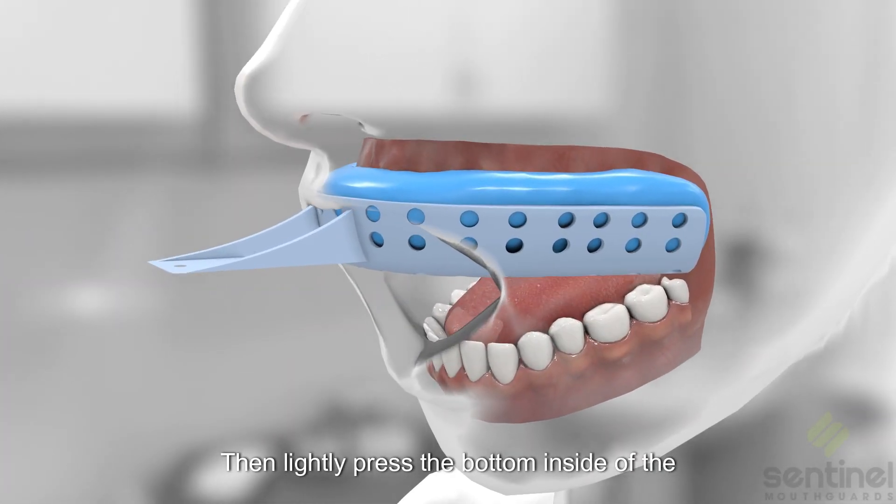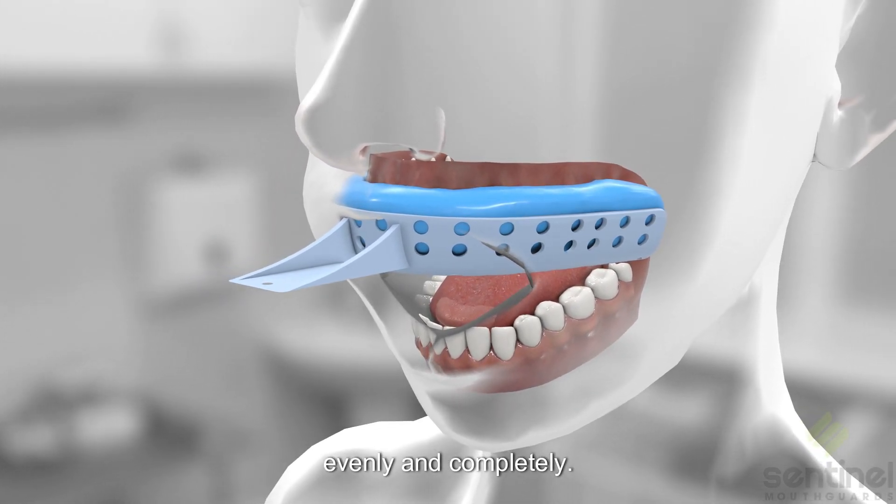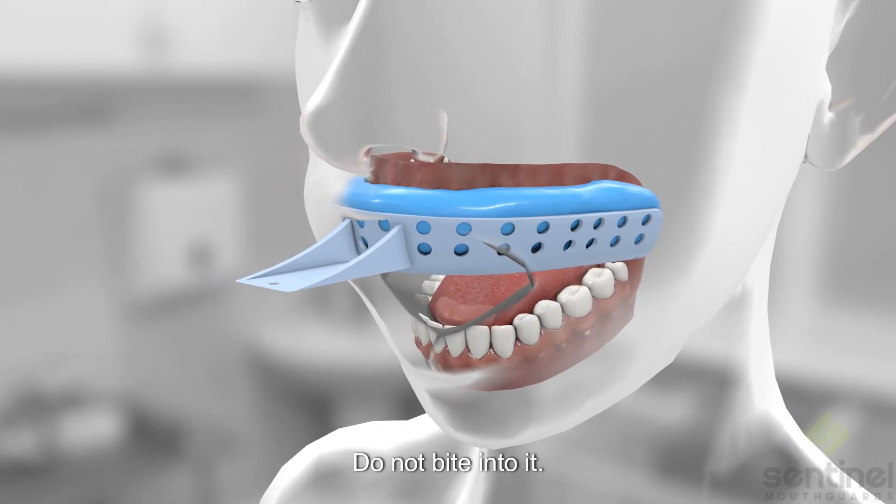Then lightly press the bottom inside of the plastic tray. Make sure all of the teeth are submerged evenly and completely. Do not bite into it.